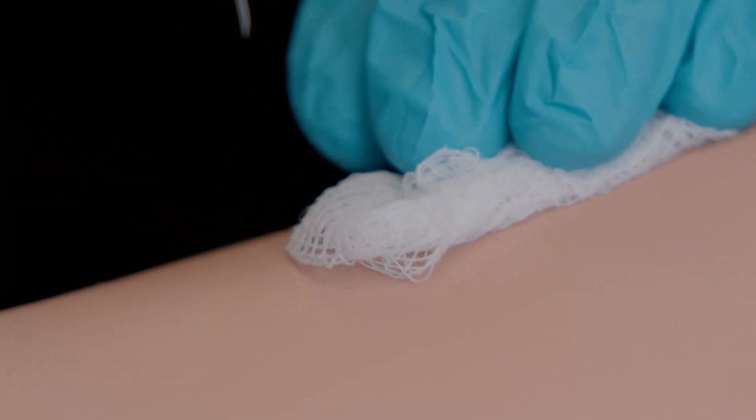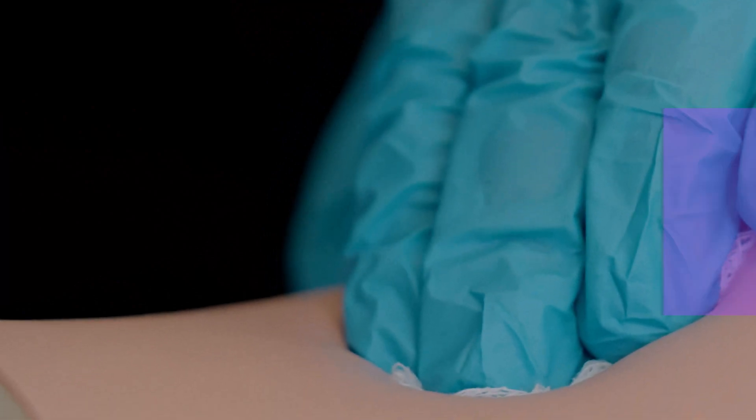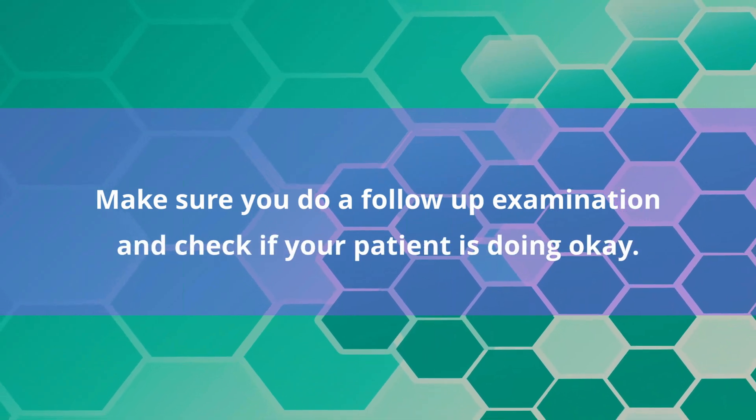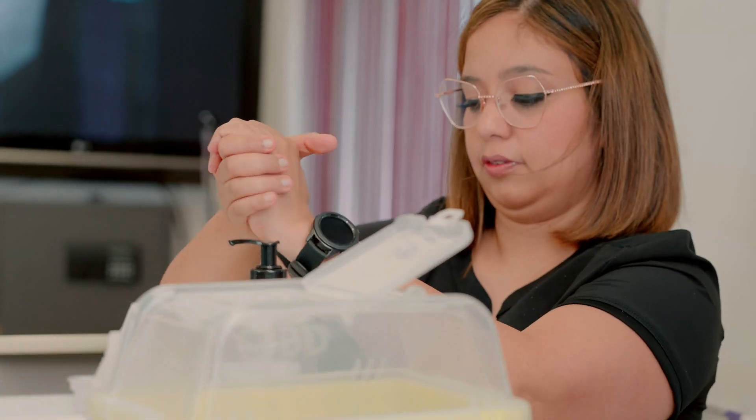Release the skin and place a gauze pad over the site, applying gentle pressure. Make sure you do not massage the area. Apply a bandage to the puncture site if necessary. Make sure to do a follow-up examination and check if your patient is doing okay. Discard used supplies and then wash your hands.